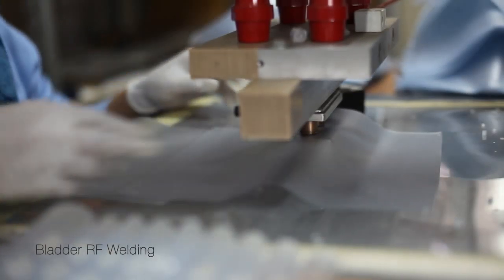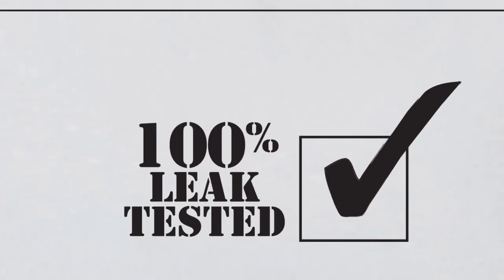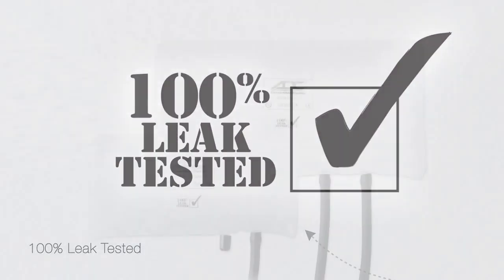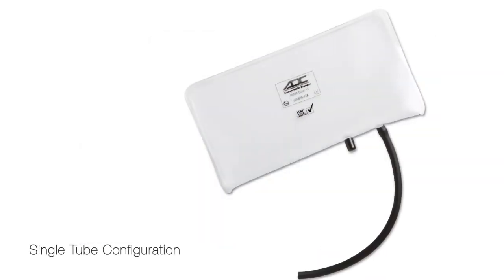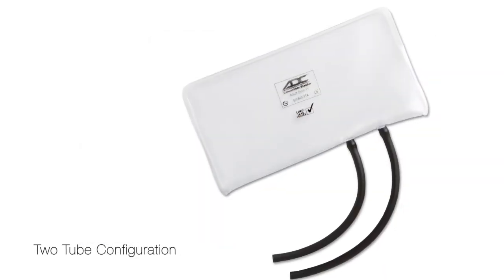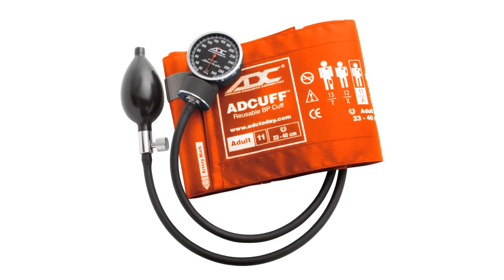ADC's ad cuff features a revolutionary latex-free bladder made from a remarkably elastic synthetic for ease of use. Our proprietary convertible design permits use with single or double tube systems, and virtually any manual or automated NIBP monitor on the market.